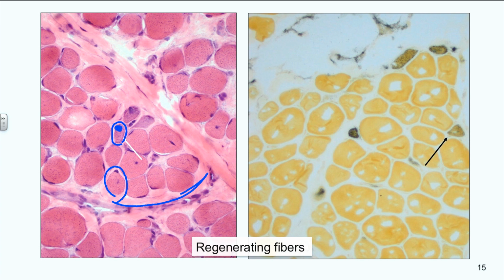Here you have again areas of the muscle biopsy where you have a lot of fibrosis, of course smaller fibers, but then there are fibers also that are very basophilic, bluish looking, with one single nucleus that is very active and plump, and these are probably the regenerating fibers. These are the ones that I mentioned in alkaline phosphatase. Also, if it's not evident on basic morphology, we can go and look for them on alkaline phosphatase.